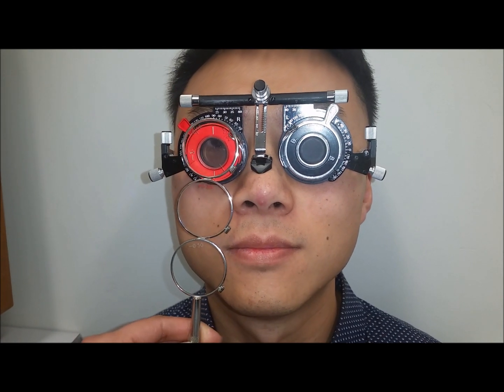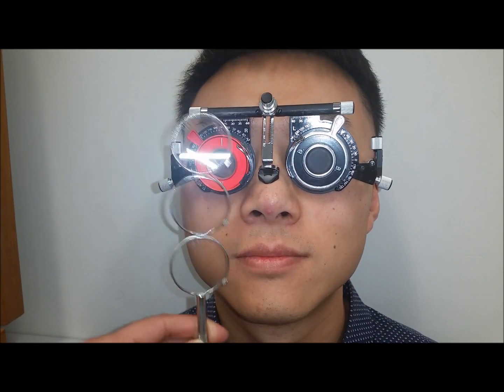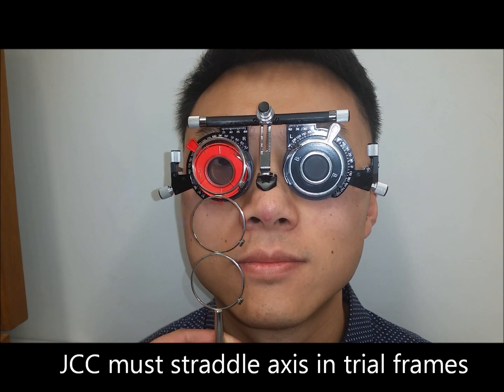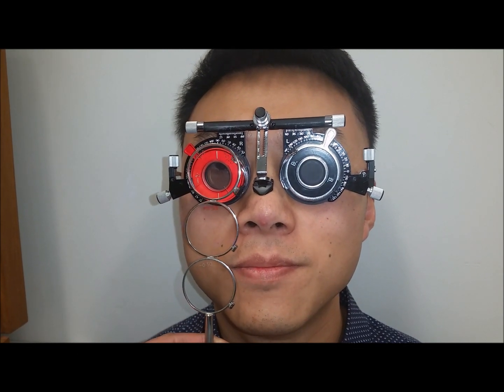The axis of the 0.5 Jackson cross cyl must straddle the axis of the inserted cylinder lens in the trial frame in both of the flip positions. Yep, so I'm just going to show you one more time. Better 1 or better 2? Better 1.